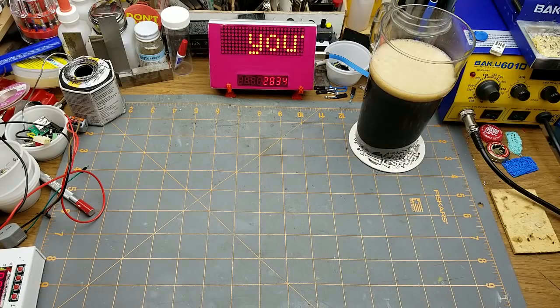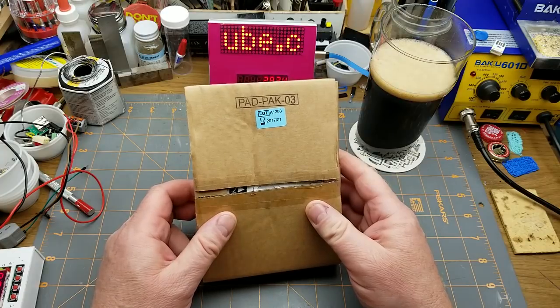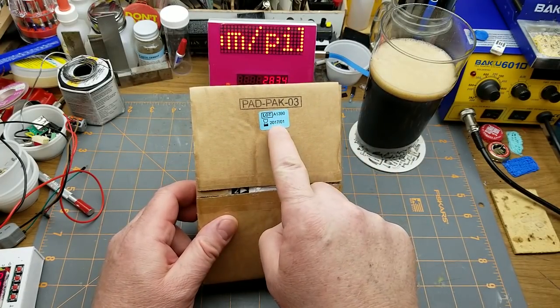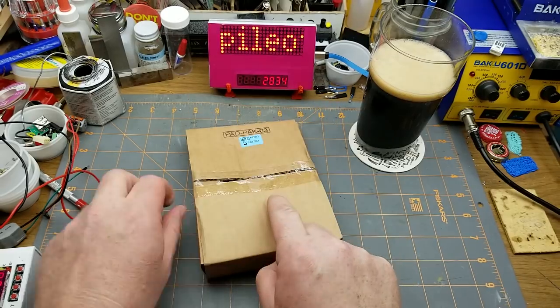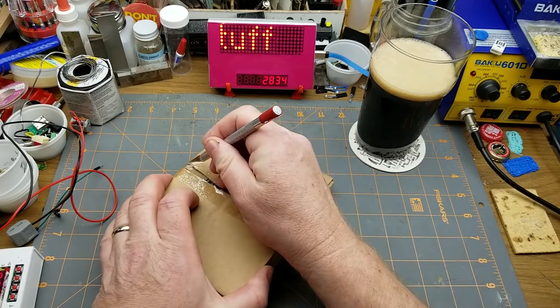Time for a teardown. Haven't done one of those in a while. And this is, as usual, something different. The box says Pad Pack 03 and it's got an expiry date of 2017, which is how I got my hands on a sealed device like this.